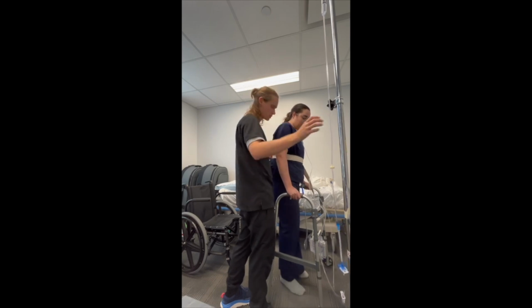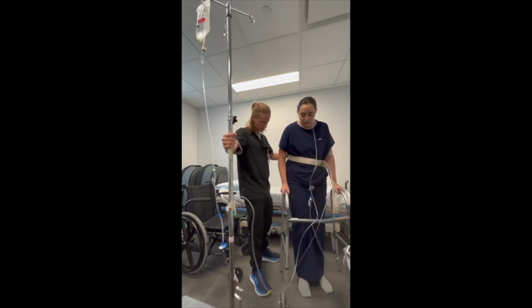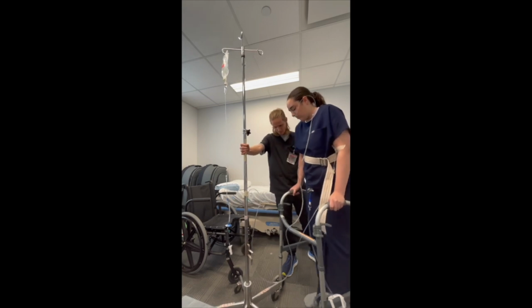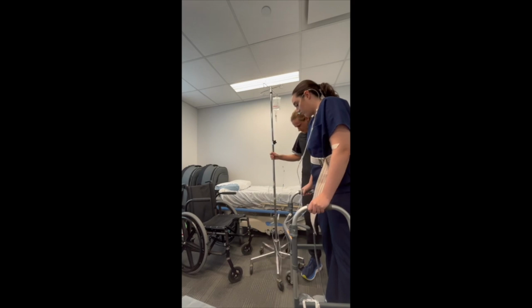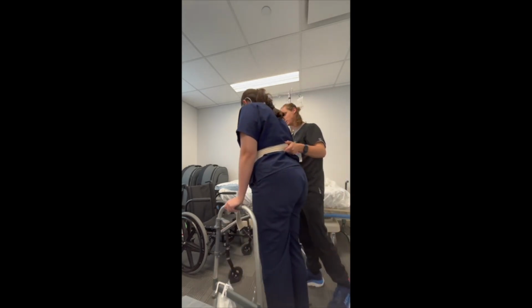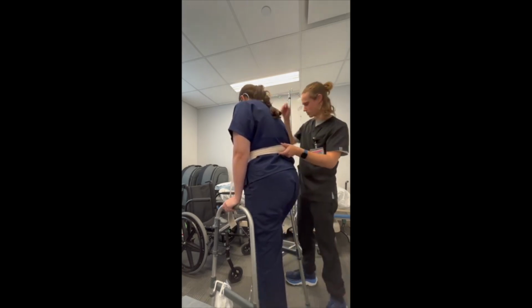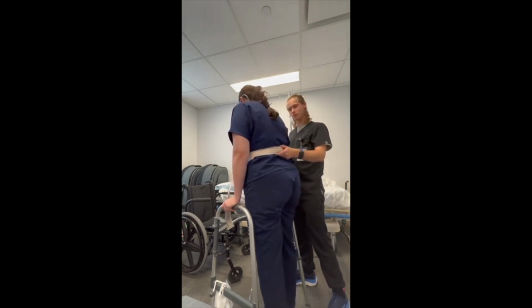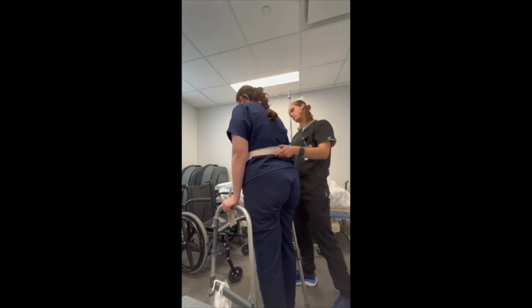I want you to turn towards this shoulder here. And I'm just going to bring this across a little bit. Good. And we're going to head back to the chair, okay? And again, once we turn around, I want you to turn towards this shoulder. As you can see, if she started turning towards this shoulder, what would happen with these lines is she would get crossed up. She might run out of line, she might pull something out, or she's going to make the transfer less successful. So I'm going to have you turn towards this shoulder here.